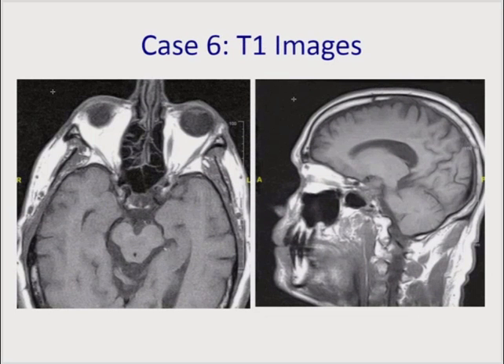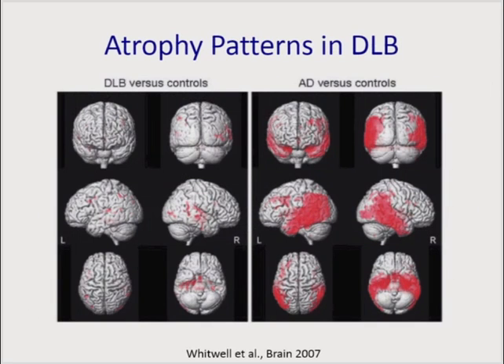So here was his structural imaging. And what's notable here is perhaps what's not here, which is a lot of atrophy. Looking at the temporal lobe structures, you can squint and maybe see a little bit of temporal atrophy, perhaps a little bit of parietal atrophy. But my take on this was that there wasn't a substantial amount of atrophy present. And overall, my thinking, given the clinical symptomology, was that this perhaps could be a case of dementia with Lewy bodies. And we've already seen this panel before.